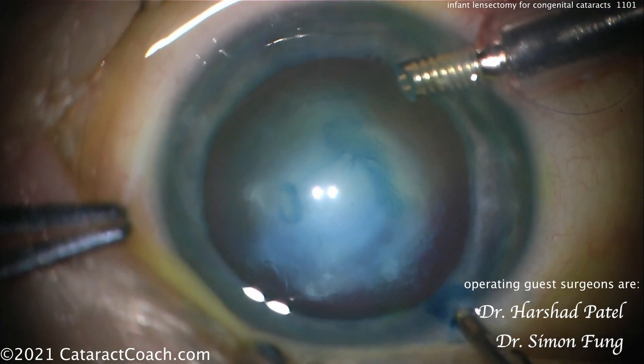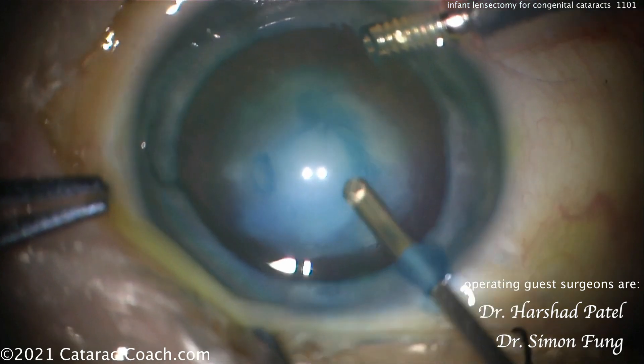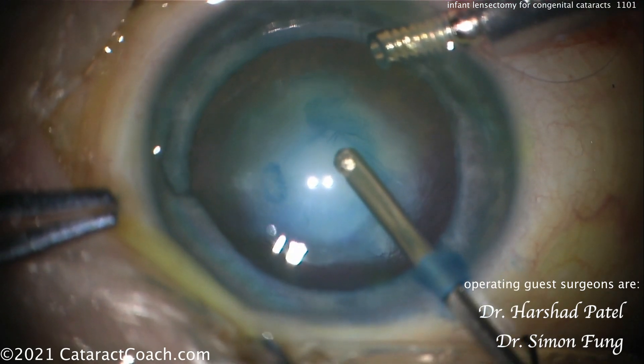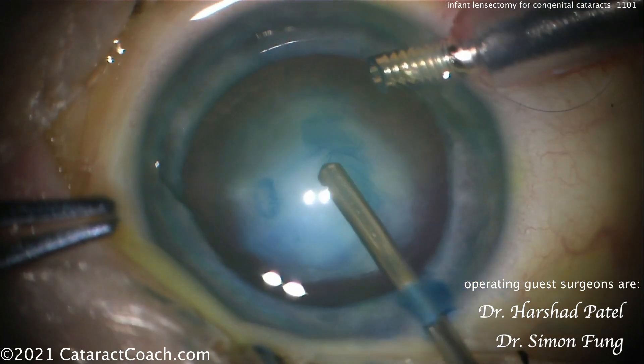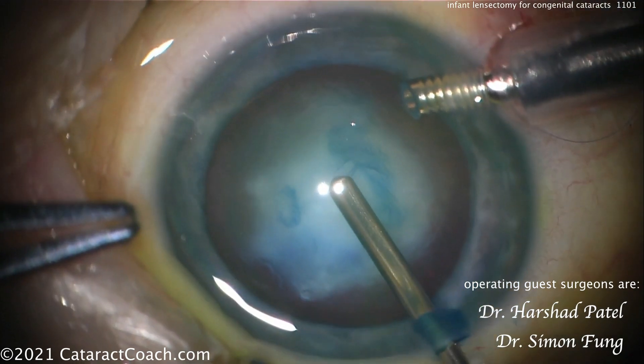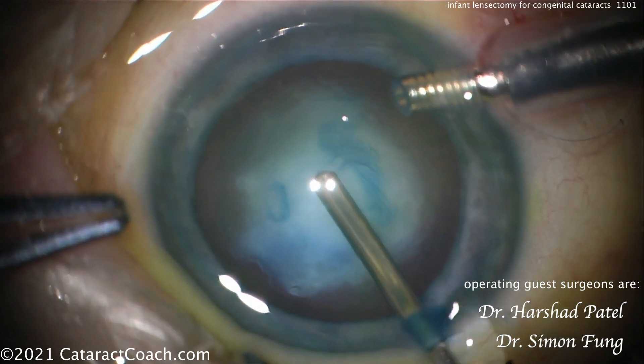Instead of a standard bimanual technique, this is a bimanual technique of sorts — using an anterior chamber maintainer to keep the eye inflated, and now using a vitrector to go inside. It looks like a 23-gauge vitrector to go and open the lens capsule.